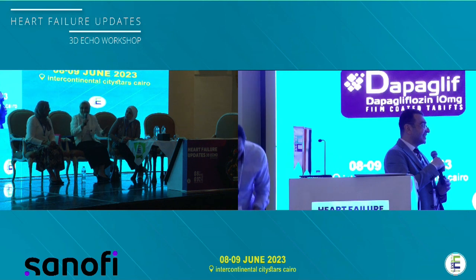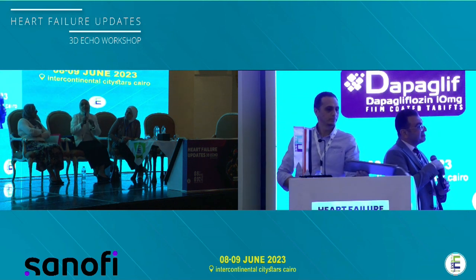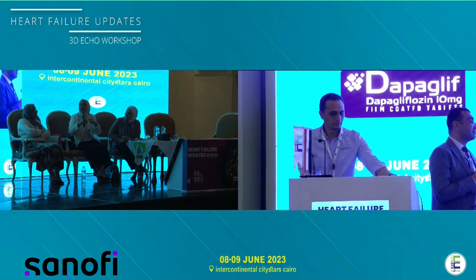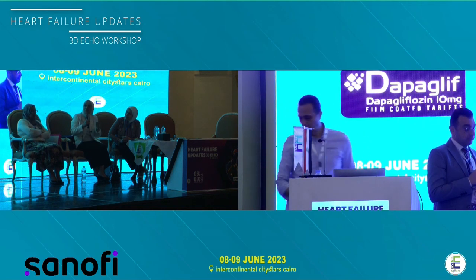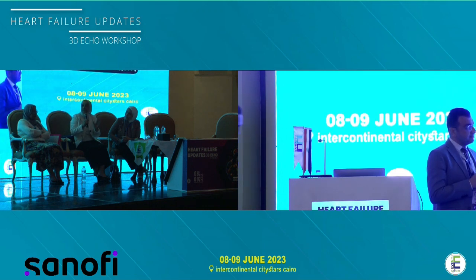Thank you very much. PFO is a different story altogether, we don't want to get into it, because it's not a matter of rims. Usually they are intact. It might be a tunnel, and the length of the tunnel speaks a lot. The choice of the device is going to differ according to the length of the tunnel, according to the distance from the SVC and the distance from the aorta. So it's something else rather than the ASD. It's the same technique but different evaluation.